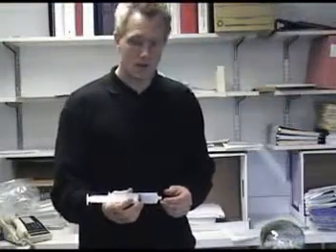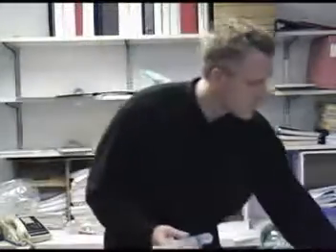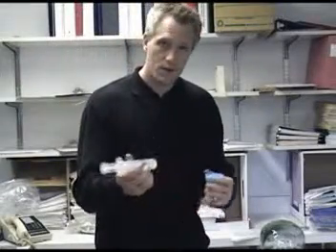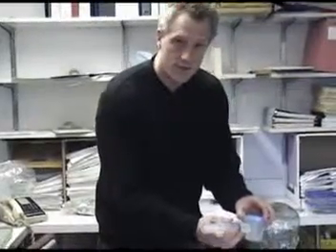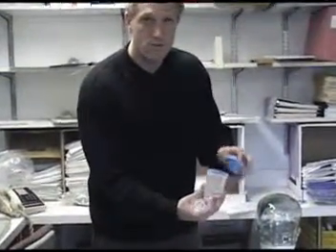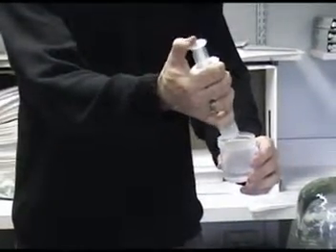Now that we've got the sample in the syringe, you've got to get it ready to go down to the lab. Simply grab your specimen container, and I can't stress enough how important it is to use good sterile technique here. You don't want to bang the side of the cup or touch the tip of this syringe against anything. You simply want to hold it up, place it into the vial, and send this down to the lab.